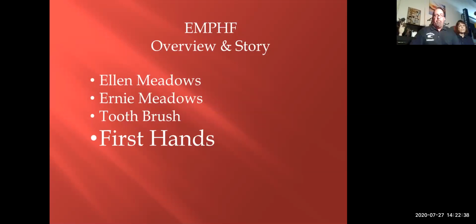Our first hands that we did, we machined them and we ground them and we filed them and we sanded them out of blocks of plastic in order to do the best we could, because certainly we didn't have the ability to mold them at that time. Oh, also back then, there was no such thing as 3D printers. So those of you who are working with 3D printers, you will find out what happened in an era before you had access to those tools.